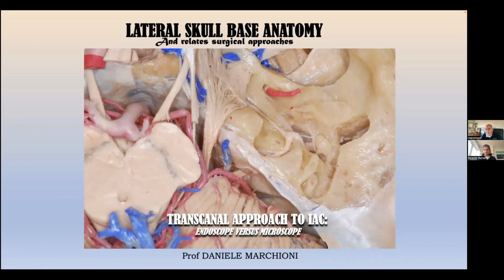approaches, because we codified the transcanal transpromontory approach just because we started to use the endoscope several years ago, and we started to understand the anatomy from the external auditory canal to the internal auditory canal, and afterwards we started to remove some acoustic tumors through the canal. But anyway, recently we also developed an expanded transpromontory approach requiring microscopic surgery. So it's not a question of the tool, but especially of the anatomy.